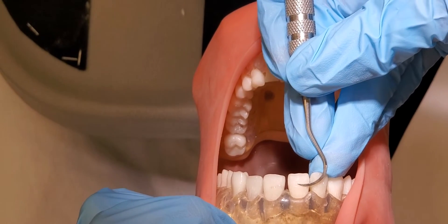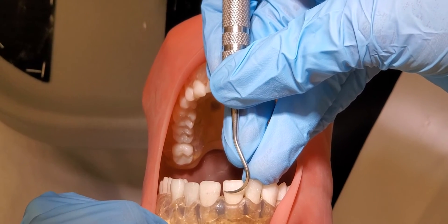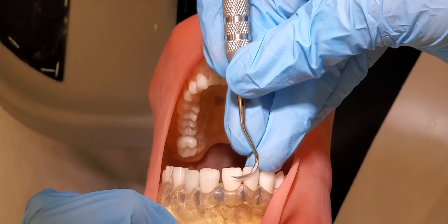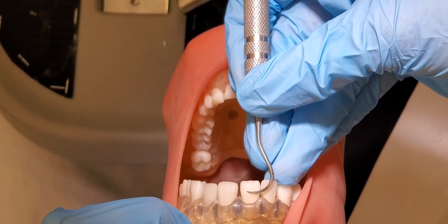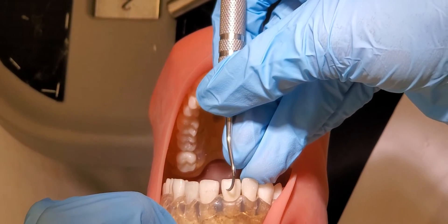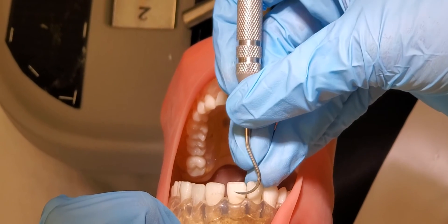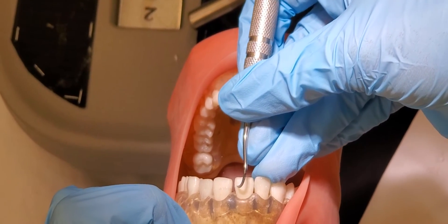If I did it incorrectly, you can see right there that my tip third is actually off the tooth, so I need to pause, keep rolling until it gets back on the tooth, and then keep going. Another thing that students sometimes do is roll a little too soon, so they've rolled but haven't kept moving the instrument, meaning they're only on the tip of the instrument rather than the tip third — which we don't want either. So it's a fine balance between rolling soon enough and rolling too soon.